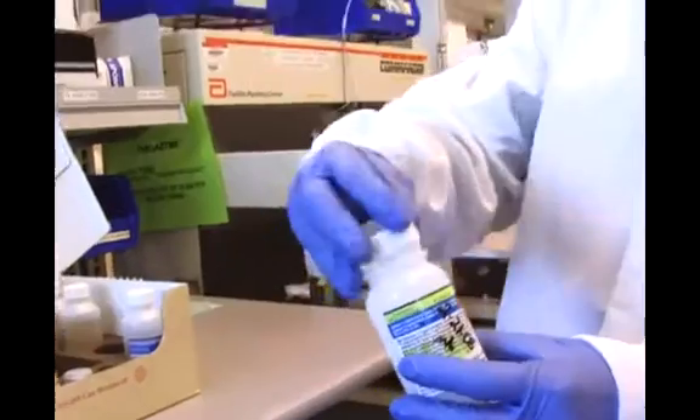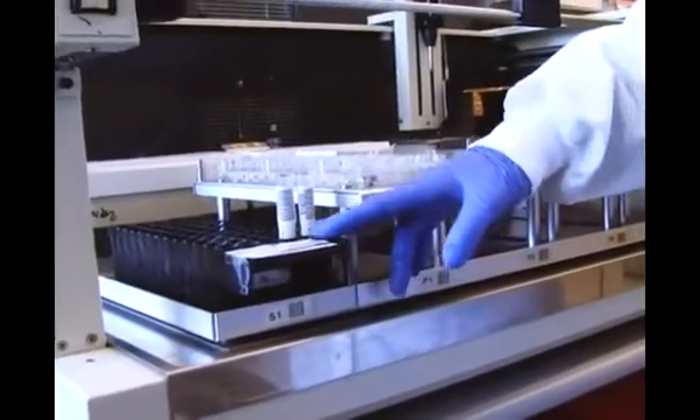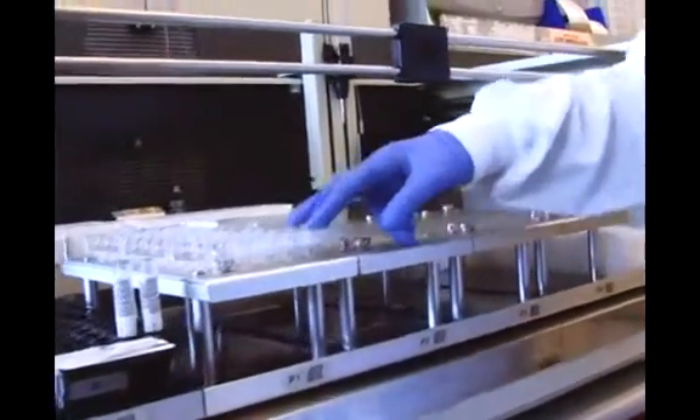So those beads are going to be dropped into a tray. The donor sample is going to be put into a source rack and then pipetted into a tray.